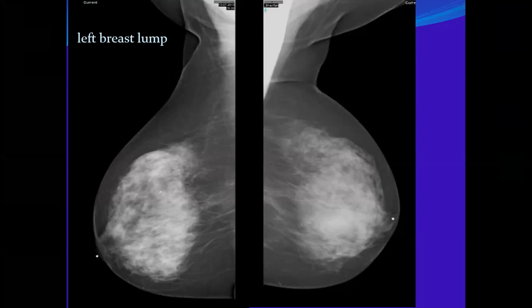I'll say there is suggestion of focal asymmetry. I'll try to correlate if it is the same location of the patient's palpable abnormality or not. Might be yes, might be not. I cannot say there is no, and there is no obvious. I might say no obvious calcification, but I cannot confidently say there is no. I cannot exclude everything based on this suboptimal mammogram.